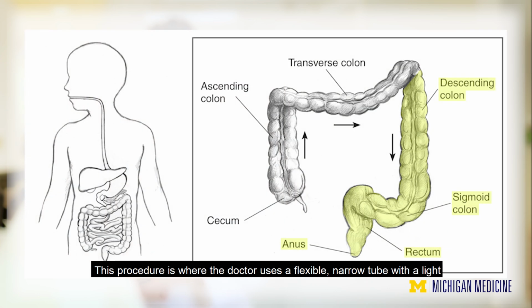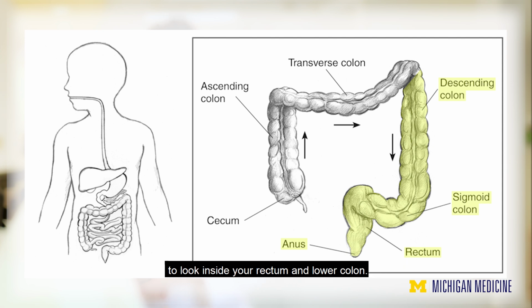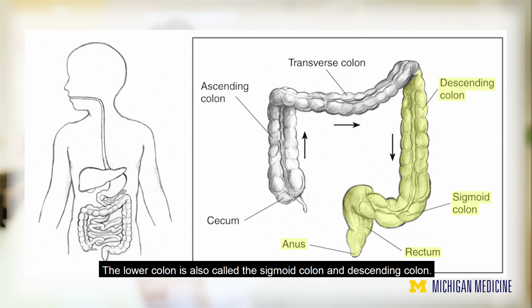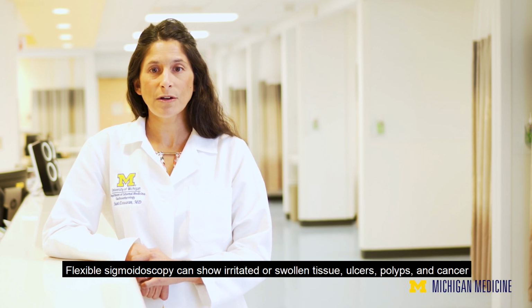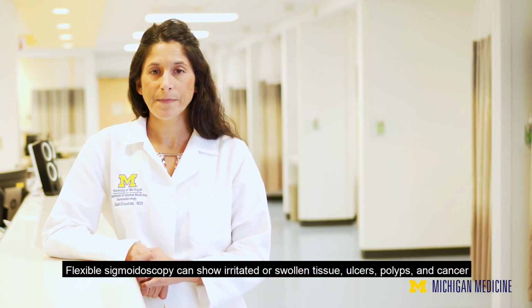This procedure is where the doctor uses a flexible, narrow tube with a light and tiny camera on one end called a sigmoidoscope, or scope, to look inside your rectum and lower colon. The lower colon is also called the sigmoid colon and descending colon. Flexible sigmoidoscopy can show irritated or swollen tissue, ulcers, polyps, and cancer.